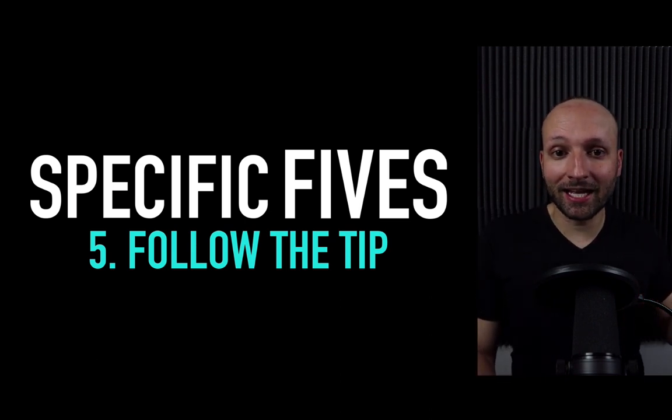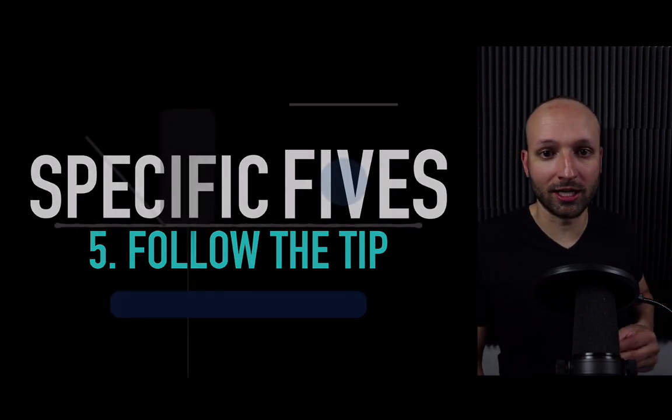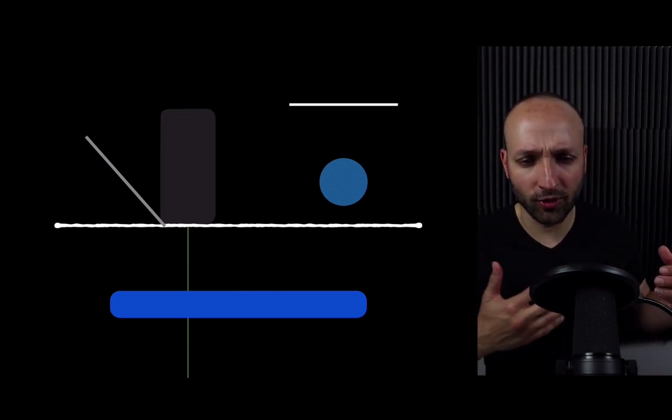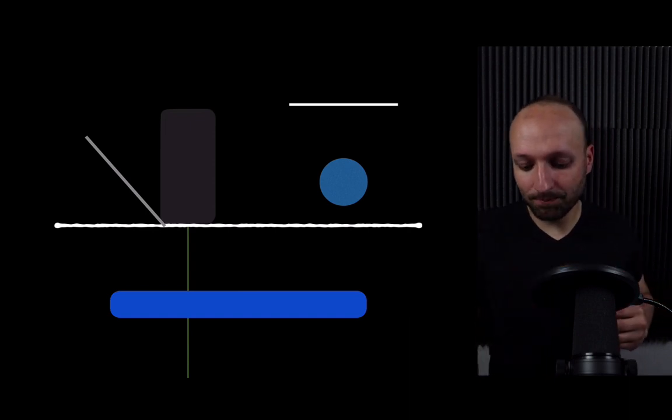But you're much less likely to have a mistake or create a complication if you're following that needle tip. So I use something that I've called sequential needle tip tracking. Other people call it other things, but I like sequential needle tip tracking because it describes the technique exactly the way that it should be done.